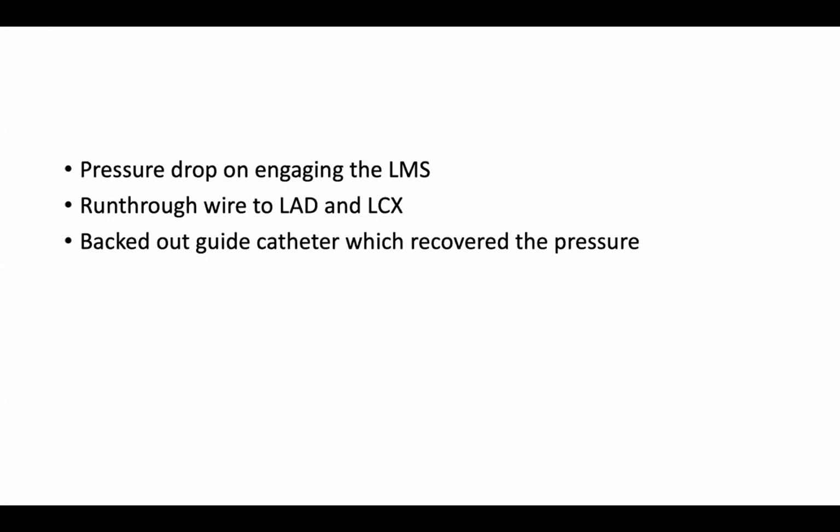So that actually gave us a clue that even though we are not seeing a very severe or moderate lesion in the left main, there must be something going on which is causing that significant pressure drop. Jawad, let's just rephrase this question, was there only pressure drop or was there pressure damping? These could be two different things here.